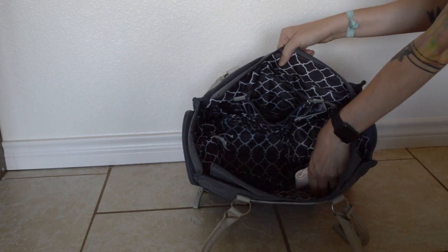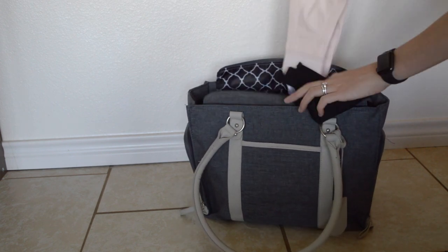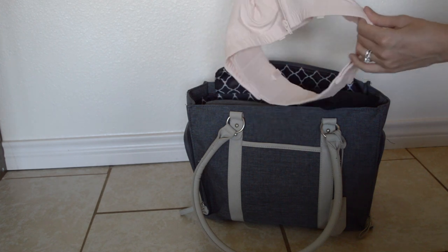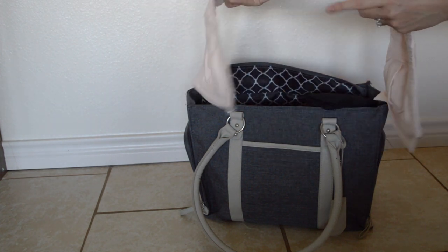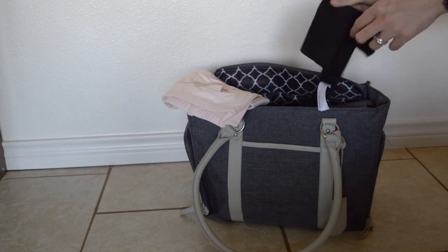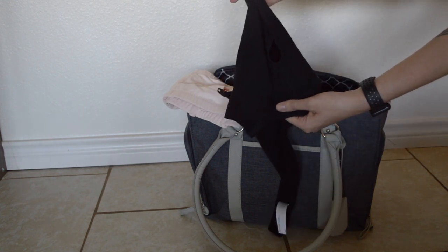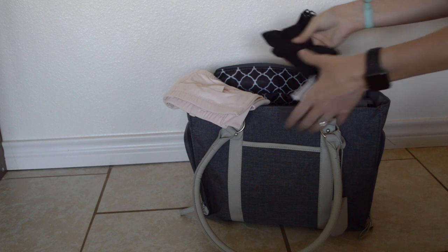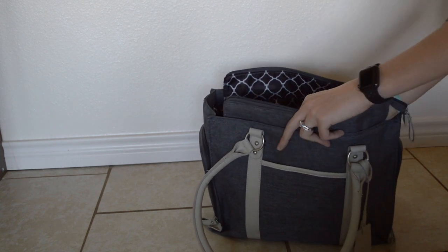In the other elastic pocket I keep two pump bras, each with a different function. The first is my regular pump bra — it's elastic all the way around, you zip it up the front, and it holds your pump flanges so you can pump hands-free. It adjusts to many sizes. The second bra snaps around and snaps right onto my nursing bra so I don't have to take my bra off completely. I use them both depending on the situation and what I'm wearing.